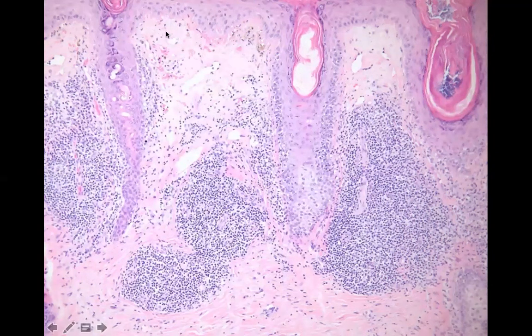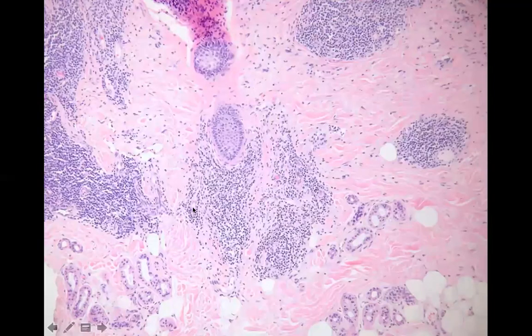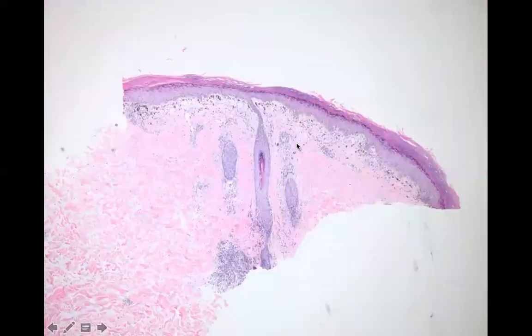which is your evidence of chronic cutaneous lupus erythematosus. This is follicular plugging, which is nothing more exciting than compact keratin, which is on the epidermis, but also involves the follicles, okay? And you see here your inflammation tracks all the way around. If you do a mucin stain or if your lab has really good hematoxylin, you'll see mucin in the dermis and deep dermis as well, which can help you distinguish. Now see, in the follicle, you got your inflammation all the way down around it on the bottom.